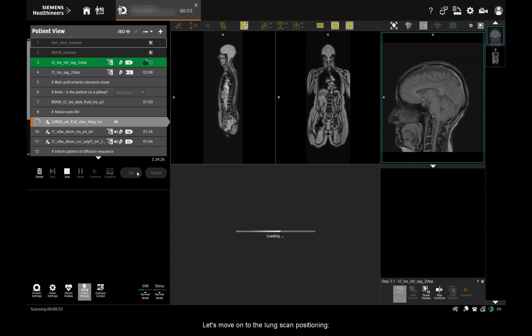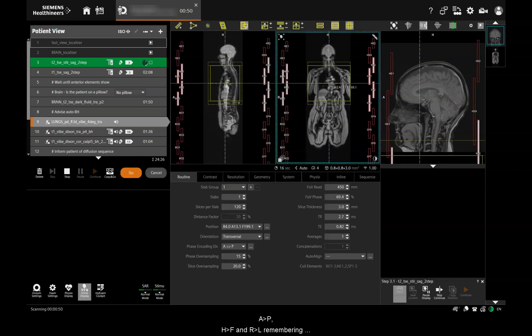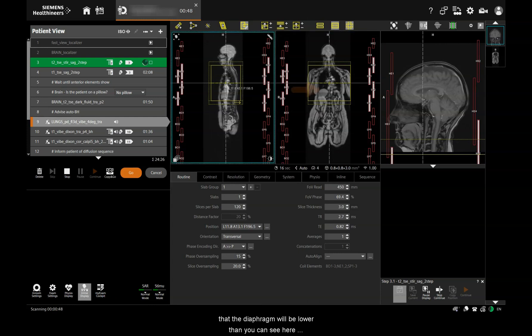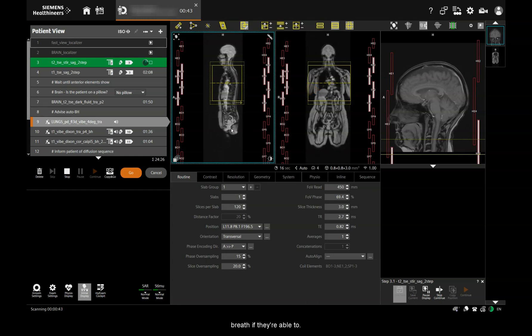Moving on to the lung scan positioning. For this, you'll want to make sure you've covered the lungs AP, head-foot, and right-left, remembering that the diaphragm will be lower than you can see here, because you're going to ask the patient to hold their breath if they're able to.